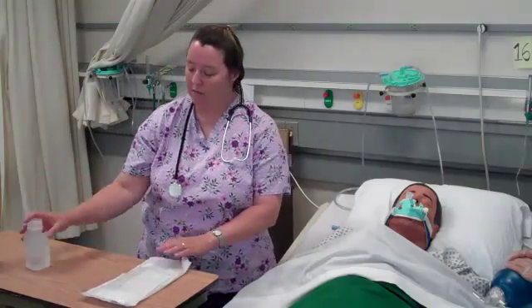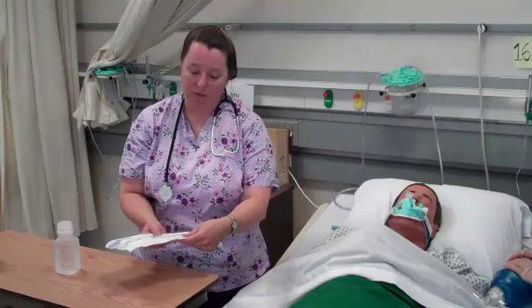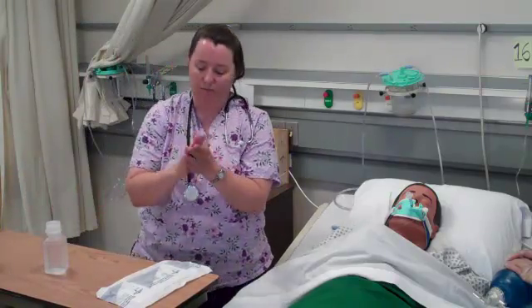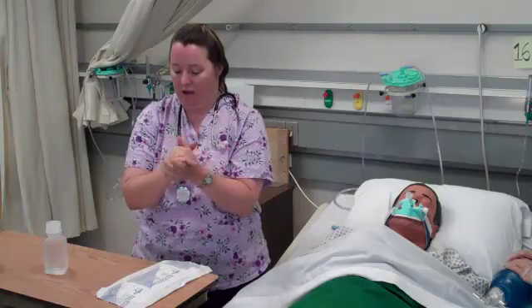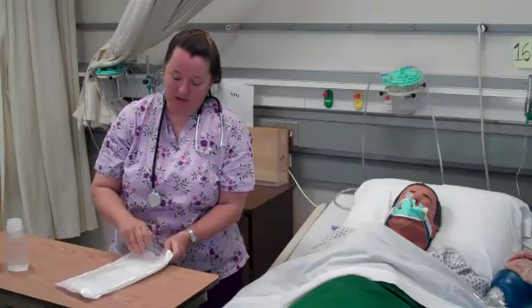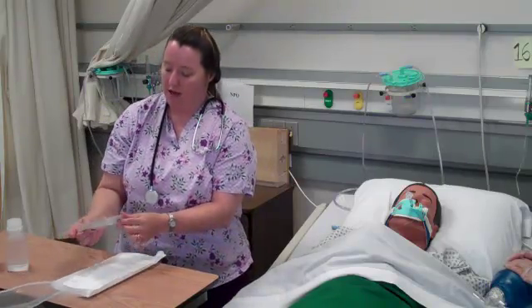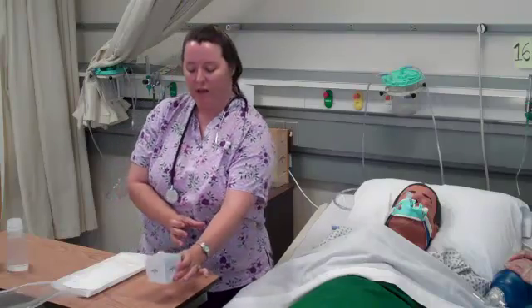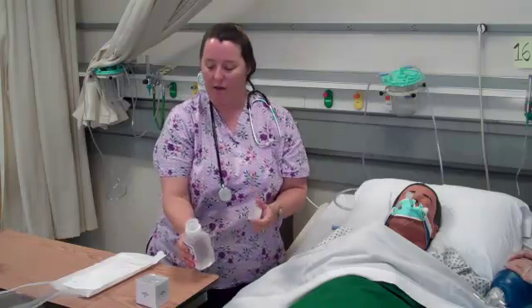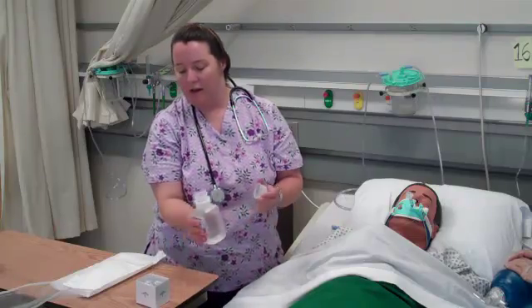I'm going to get my equipment ready, making sure everything is the appropriate sizing, the appropriate kit, and that nothing is expired. I'm going to wash my hands. Opening up the packaging, this kit comes with a small cup for the saline. I'll open it up using sterile technique — I'm not going to touch the inside. I'll pour the saline without touching the fluid to the container, and get my saline ready.